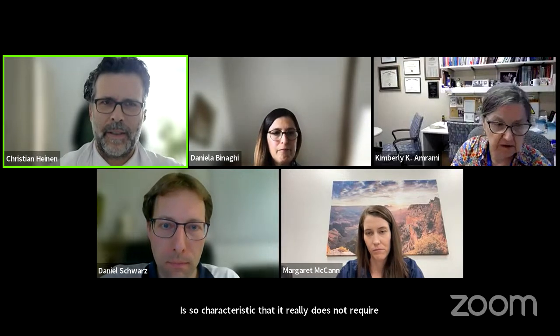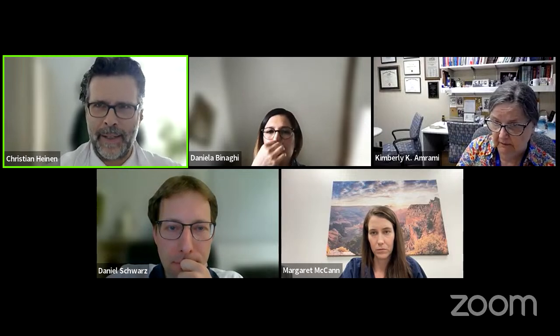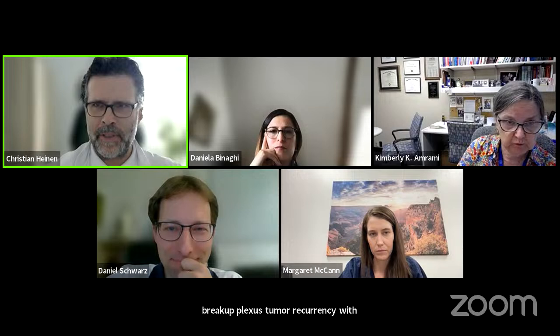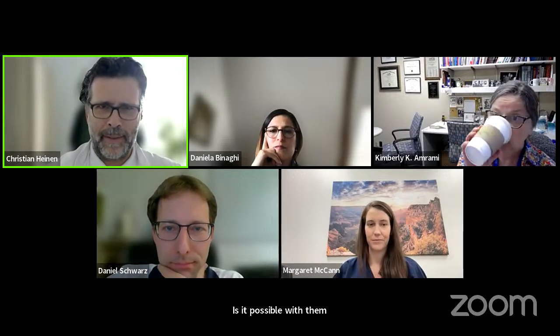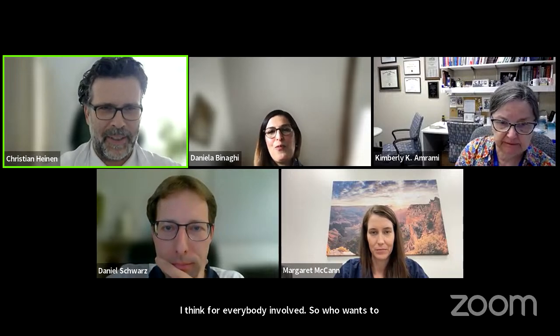Okay. There's a very interesting question from our good friend Carlos Rodriguez from Mexico. He asks, first of all, wonderful talk. What about the distinction between a brachial plexitis post-radiation versus a brachial plexus tumor recurrence with MR? Is it possible with MR, or do you recommend in addition a PET? This is a very challenging and interesting question, I think, for everybody involved. So who wants to start? Daniel, do you want to?